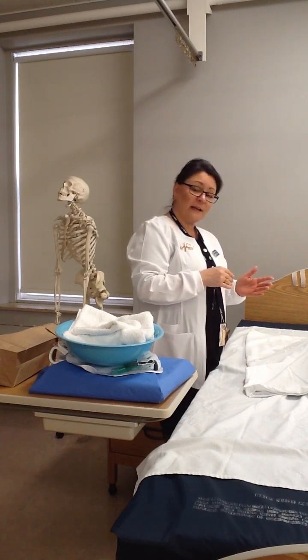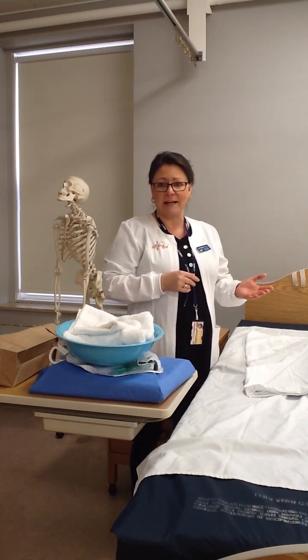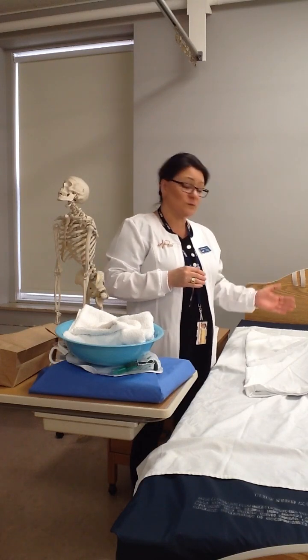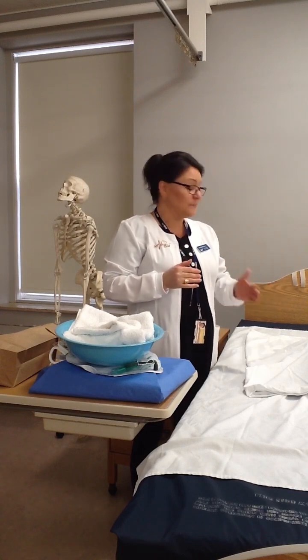When I've done that, then I'm going to have a conversation with Jesse. I'm going to explain that the doctor has ordered a catheter to be inserted. Find out how Jesse feels about that, if he's ever had a catheter inserted before, what to expect, and answer any questions that he may have. I'm sure most patients, when they have to have a catheter inserted, are quite nervous and sometimes fearful. They're afraid of pain.